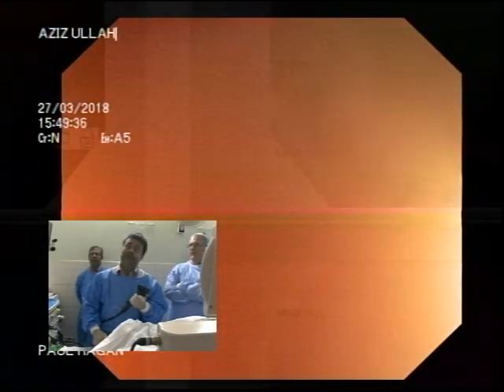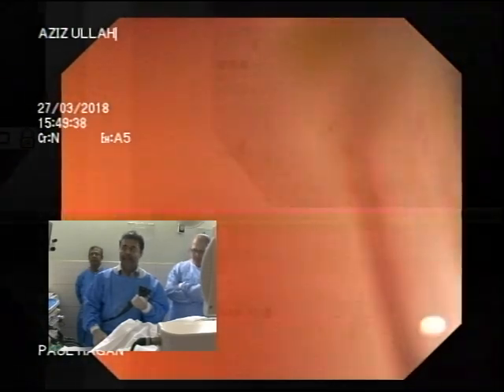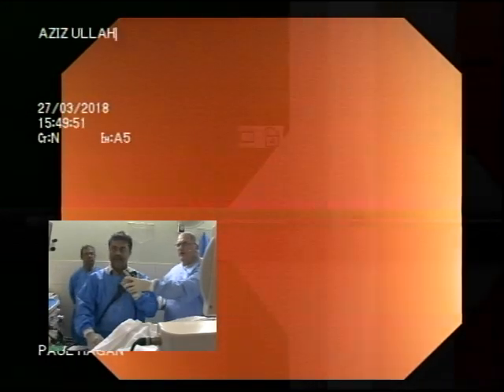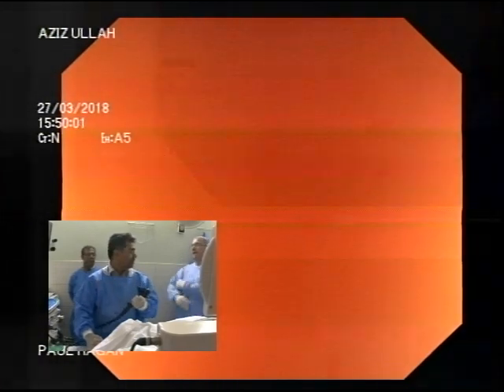So what do you want to do? I just want to go to the 1 o'clock position. Okay. And so what do you think is going to optimize it? You obviously haven't got the strength in the right hand to apply the torque. Yeah. You're finding this difficult to actually apply. So one way of applying 90 degrees of clockwise torque is... Okay. Yeah. On the back. Yeah.